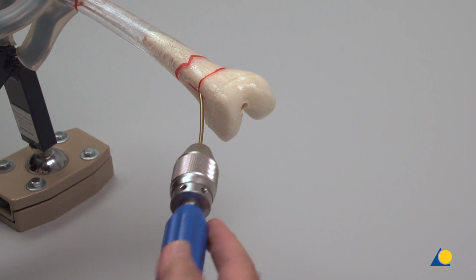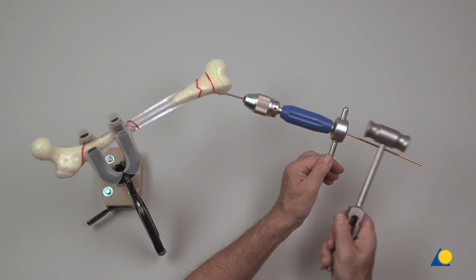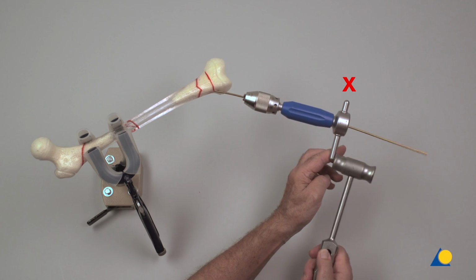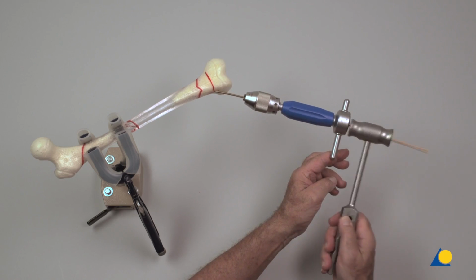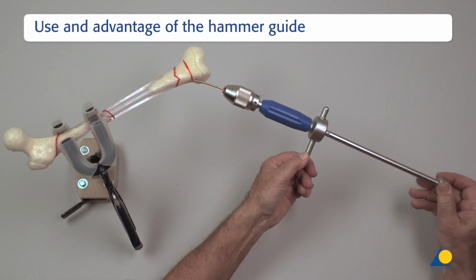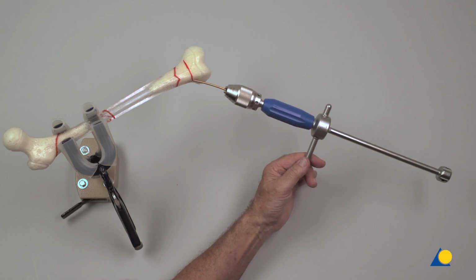The nail is advanced manually up to the fracture site using oscillating movements or with gentle blows on the impaction surface of the inserter using the combined hammer. Note that direct blows on the T-piece of the inserter must be avoided, as this may damage the inserter. The hammer guide is threaded into the impactor of the inserter and tightened. The mark on the threaded part of the hammer guide indicates completion of insertion.